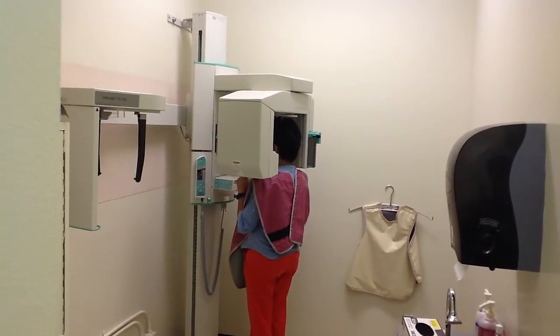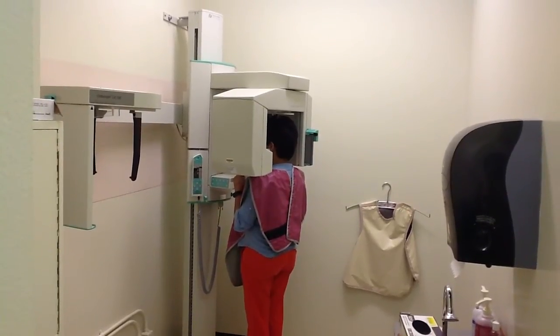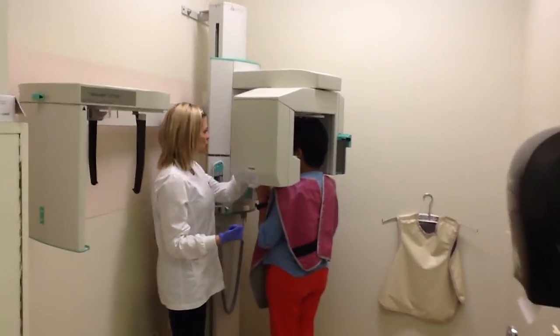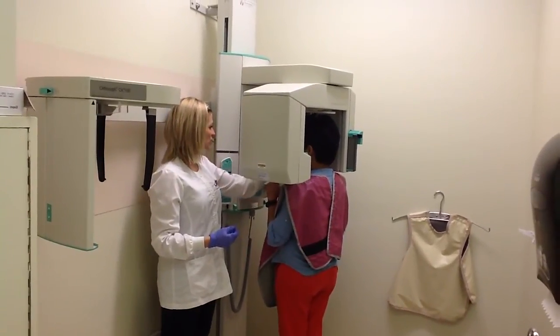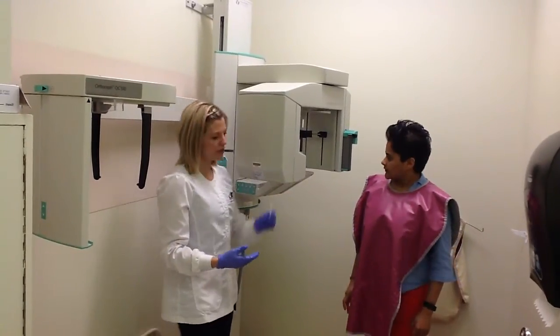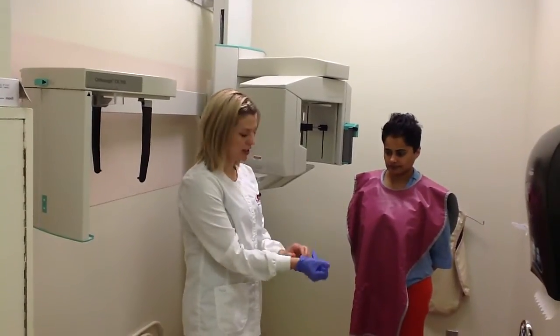Great. So now that it'll stop, and we hold it for 1, 2, 3 seconds, and then we release the exposure button. At this point, we can come in and help our patient. We're going to loosen the calipers and instruct the patient to back out slowly. Excellent. I will then remove the white bite block and remove my gloves before I touch the apron.